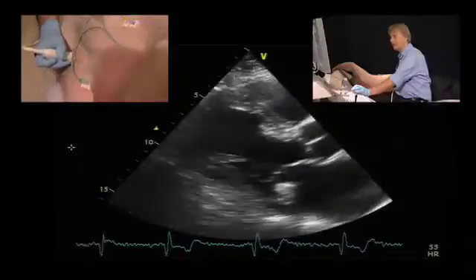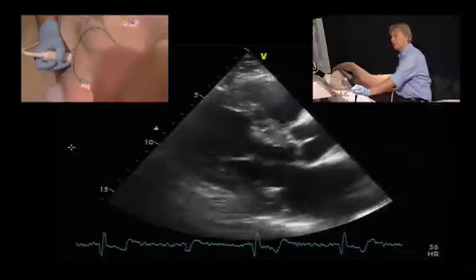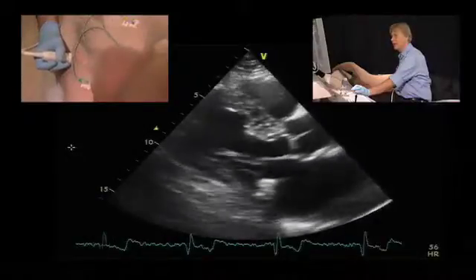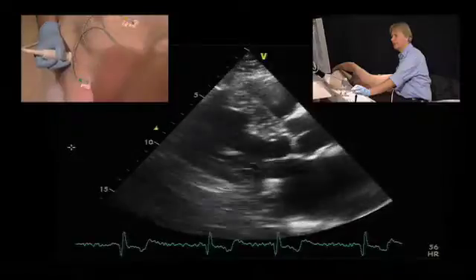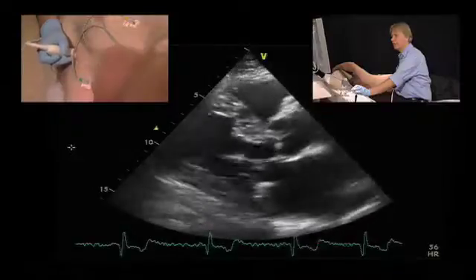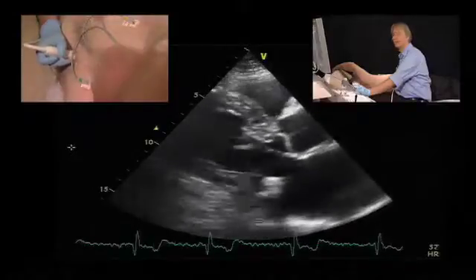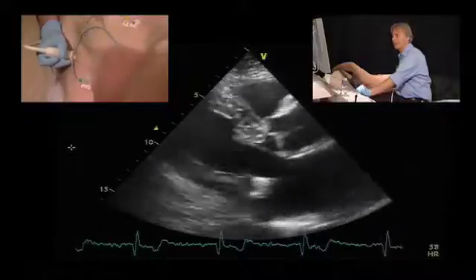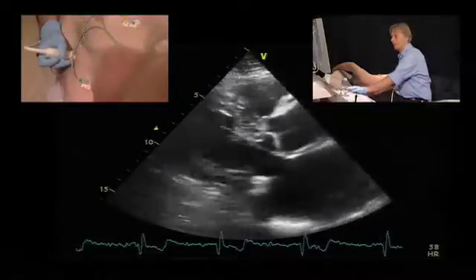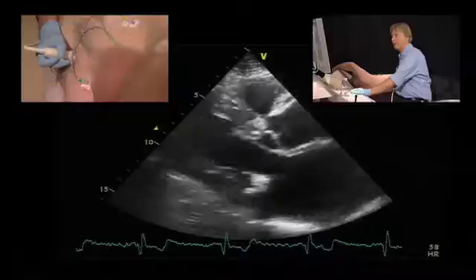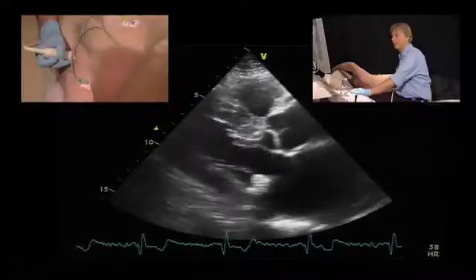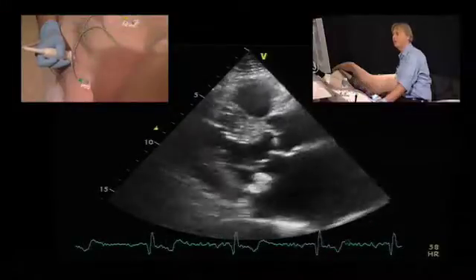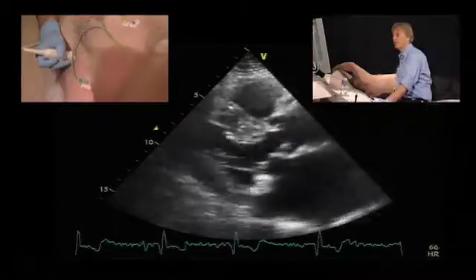The next thing to look at is the structure of the mass. It is fairly echogenic but does not seem to be as echogenic as calcium. So it is perhaps fibrotic, or also lipomatous, because lipomatous tissue can also be very echogenic.